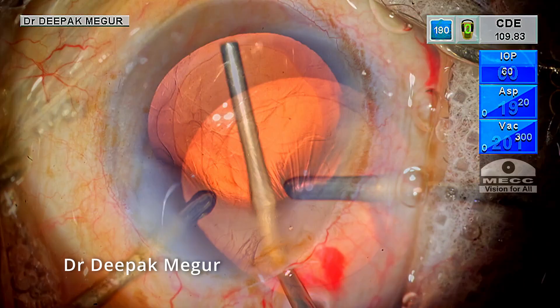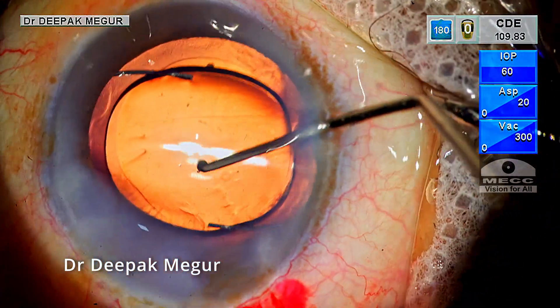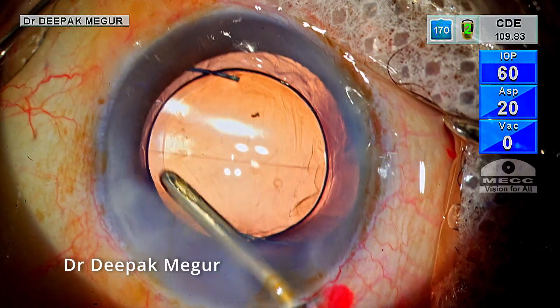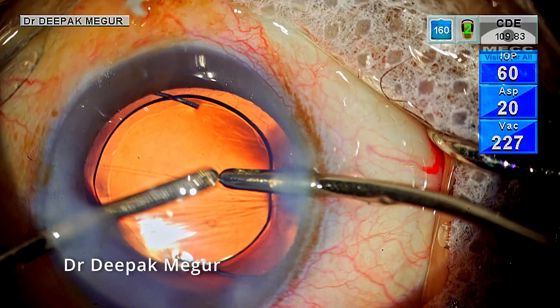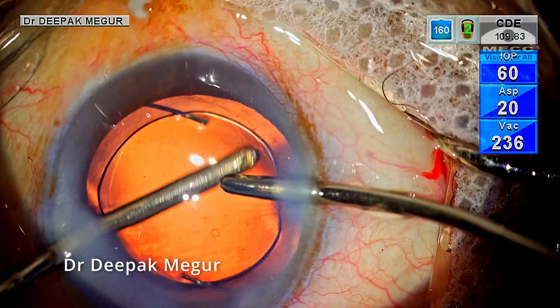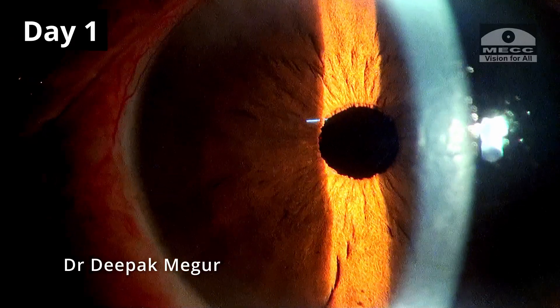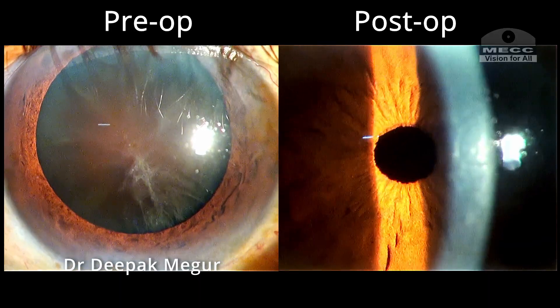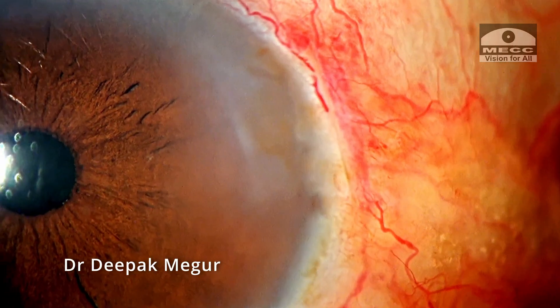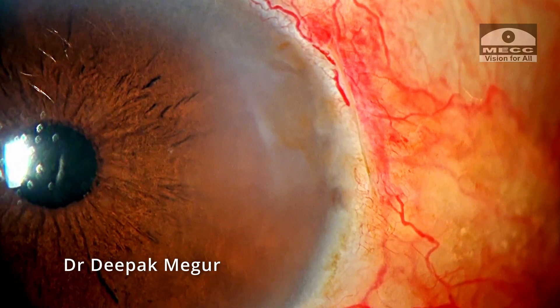Time to remove the cortex. It is done. The lens is implanted into the bag, the OVD is removed, the incisions are hydrated, and that's it. Now it's time for the results. It's heartening to see a cornea like this on the first post-op day, even with a black cataract. The wound does look healthy — there's no gape and no evidence of any burn.